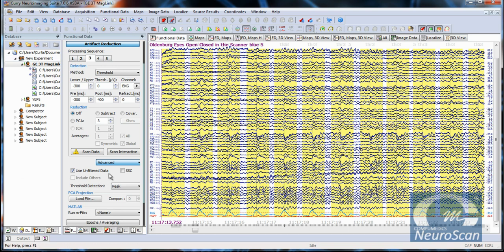And then I'm going to set up my other parameters. Again, using unfiltered data. I do not want to use the peak in this case because I filtered my EKG signal on the remnants of what looks like EKG to highlight again that distorted T wave. And I want to work off of the first slope of the T wave. I find that gives me more regular intervals between each of my EKG events. So we can see the peak of the measurement that we're getting from our EKG signal, and then just slightly lagged behind it is our major event or major marker of the ballistocardiogram.